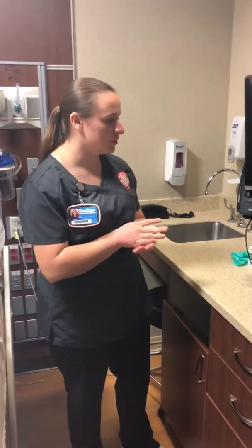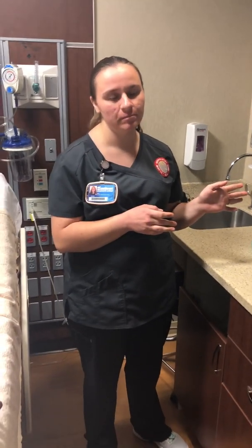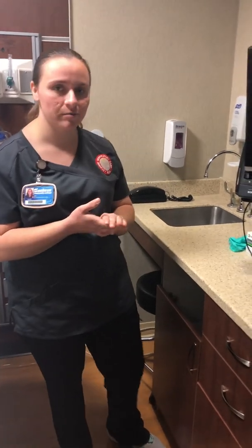Alright, today I'm going to do an ABG. The first thing I need to do before I go into the patient's room is always check the charts, to see if they're on any medication that could cause them to bleed longer, in case I need to hold the site a little longer after I draw the blood.